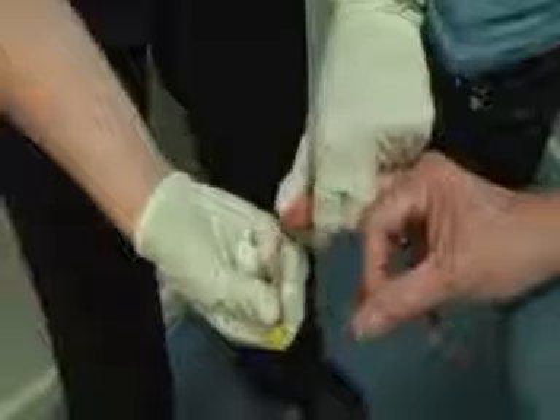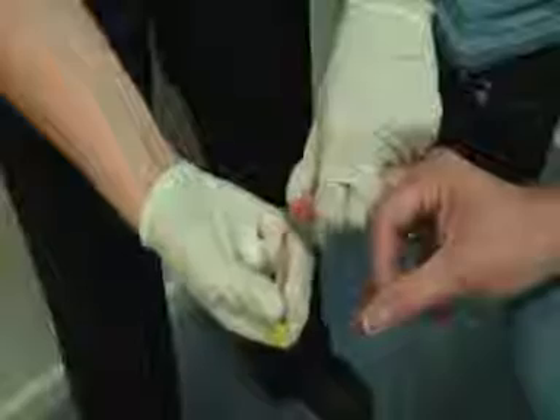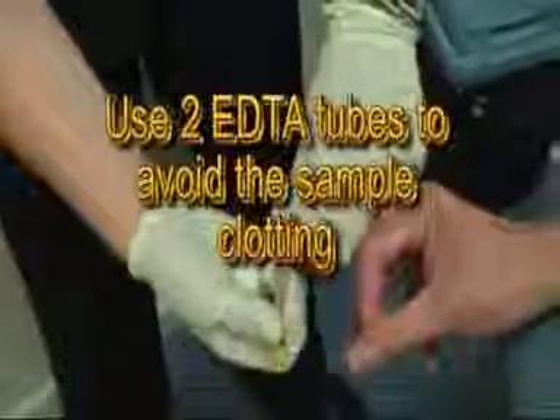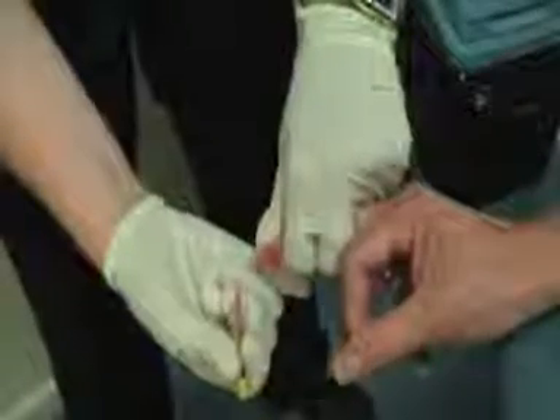It's also important to remember that if you are using an EDTA tube, it needs to be collected first in the order of draw. We actually need to use two EDTA tubes. We collect EDTA first in order of draw with all capillary collections to ensure that the blood does not clot. We do this because the initial blood flow is the greatest.